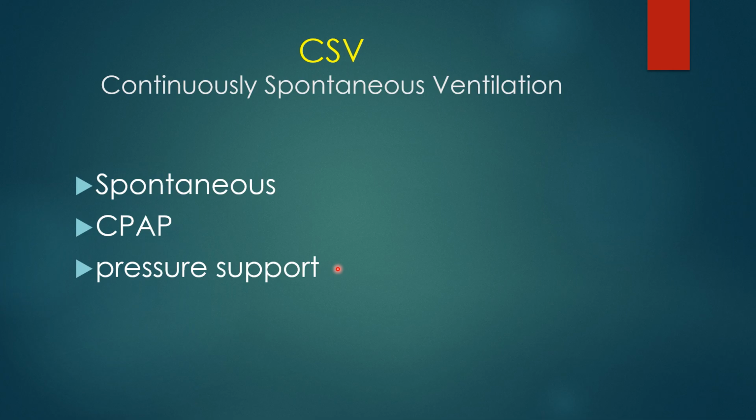So if we put the patient in pressure support and say give him 8 centimeters of pressure support, and he's breathing fast and shallow, well, he needs more pressure support, so we might turn his pressure support up to 10 or 12. But if it takes like 16, 18, 20 of pressure support, the patient probably needs some kind of control ventilation where we deliver a tidal volume or deliver an inspiratory pressure and pressure control.